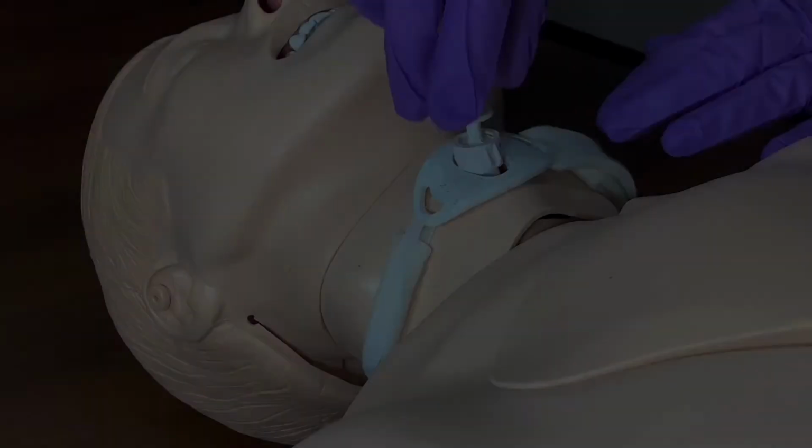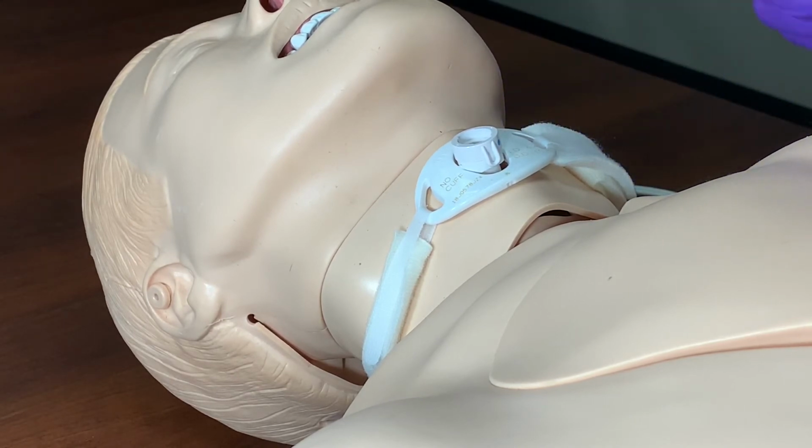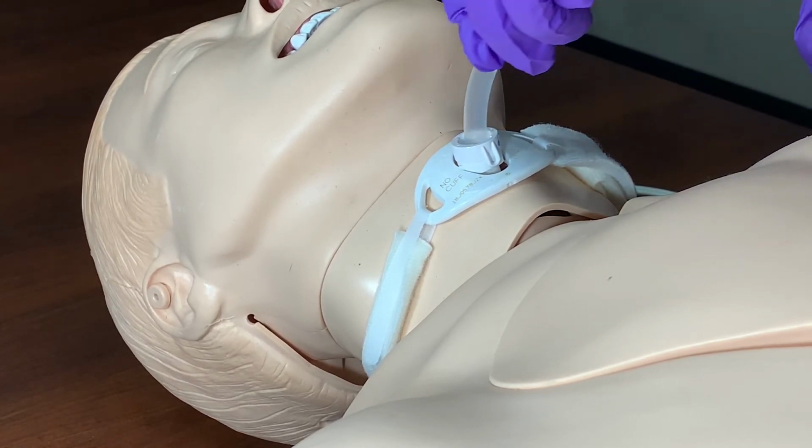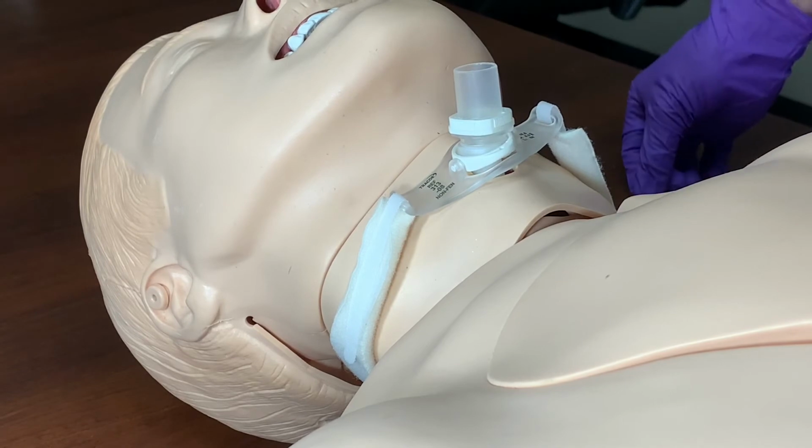Once the tube is in place, remove the obturator from the inside of the tube. With some trachs, you will have to exchange the obturator for an inner cannula, whereas in other brands, the obturator is made to fit with the inner cannula in place. At this point, you can secure the tube to your neck with the Velcro tie.